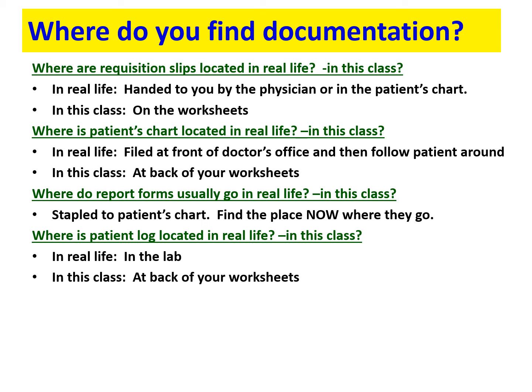In other words, you may have electronic requisitions that print out that have stickers that you peel off, and there's a sticker on that electronic requisition form that you peel off and stick onto your patient's log that is in a 3-ring binder housed inside your lab. And it could be at some point someone's job to then take those logs and scan them into the computer.